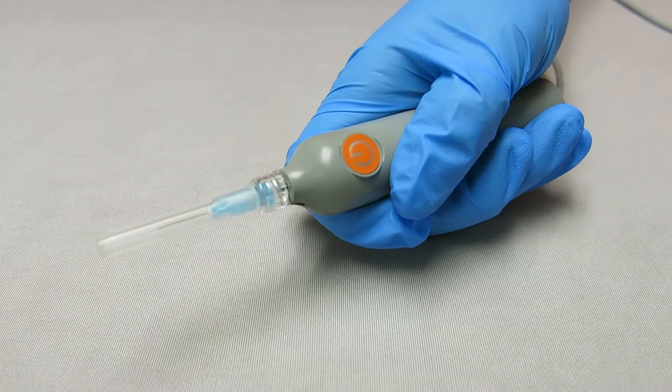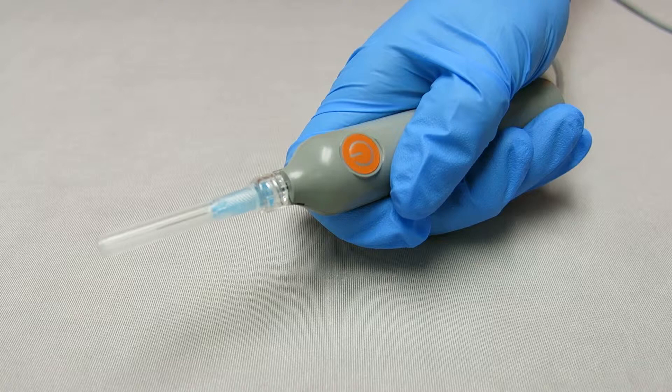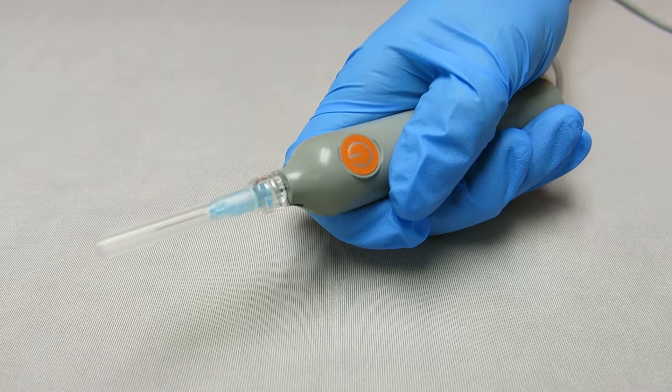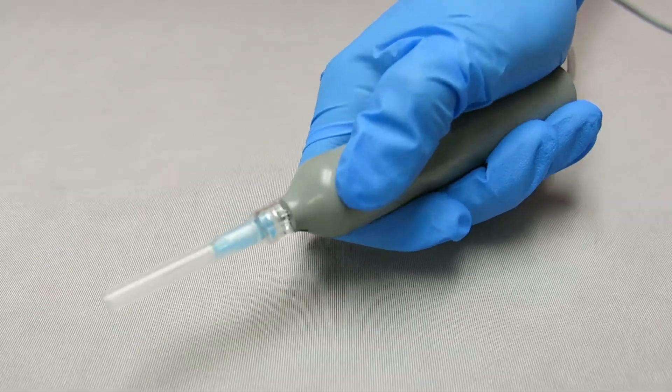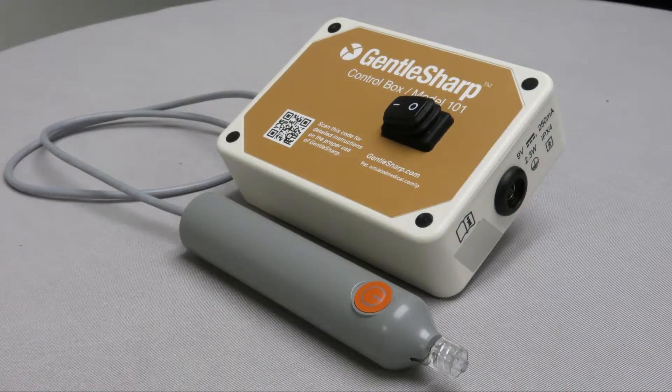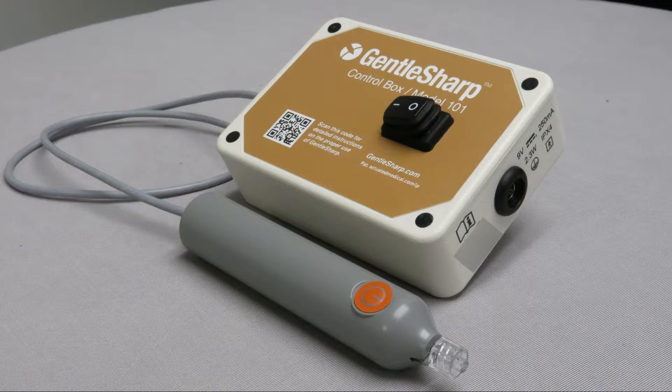verify handpiece vibration by firmly pressing the start-stop button on the handpiece. The handpiece will produce an audible tone when started and you'll feel a slight vibration in your hand. Once you feel the vibration, press the start-stop button to stop the vibration until you're ready to begin blood sampling. Now that you have everything set up, let's move on to our operating instructions.